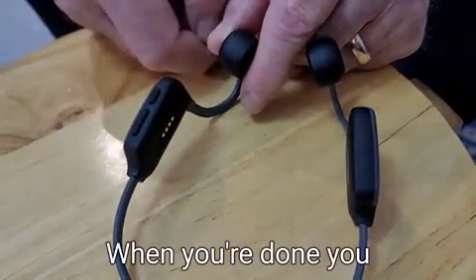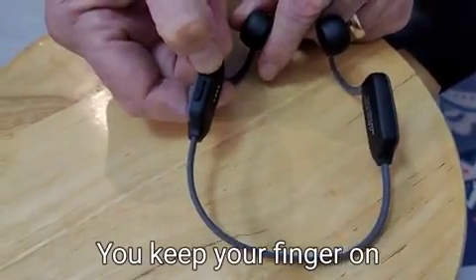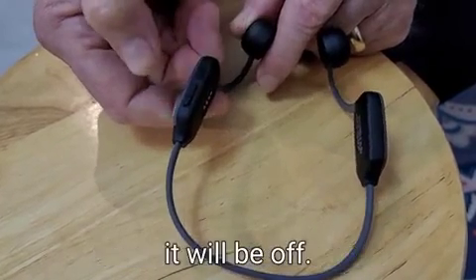When you're done and you want to turn it off, keep your finger on the multi-function button for two, three seconds and it will be off.